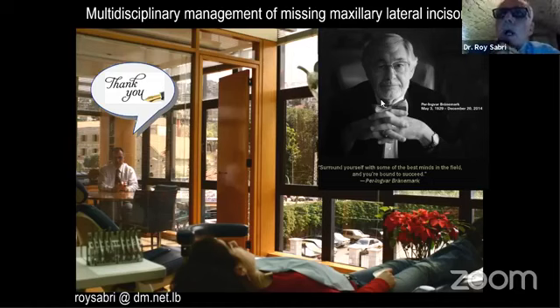Not necessarily. I can put the bracket of the canine because it fits better. It fits better because the bracket of the canine is a little bit curved. Now, depending on the canine, if the canine is flat, you can put the bracket of the lateral. If the canine is not very flat, you can put the bracket of the canine.